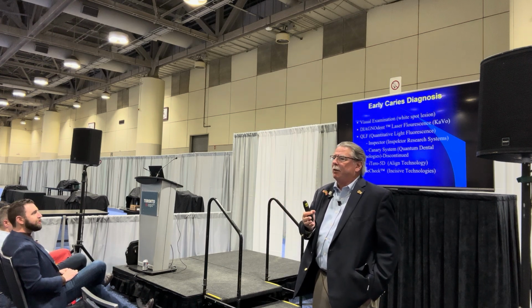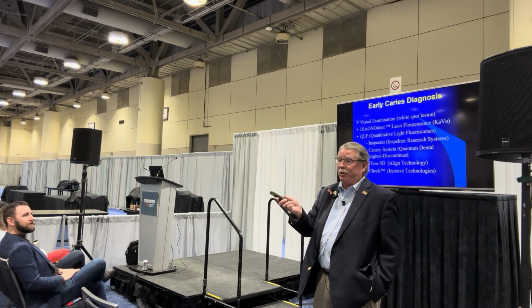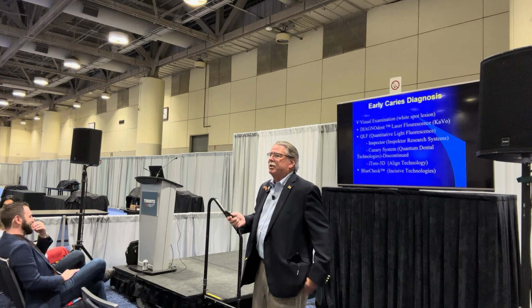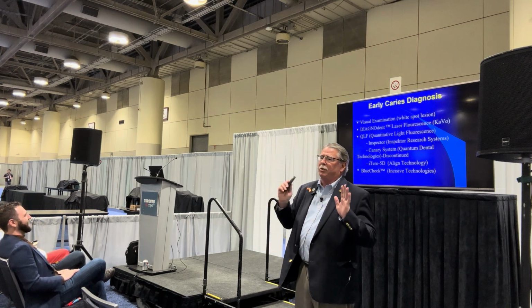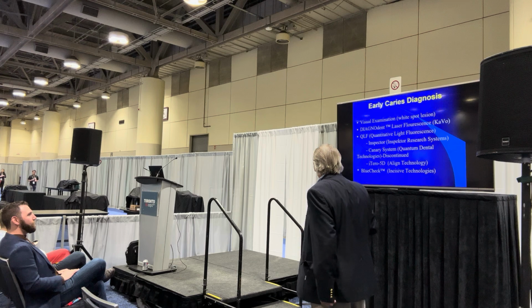So anyway, we did all these examinations to try to validate the different systems, and then we came back after that. We got the kids to give us their teeth back and paid them a fortune, and let me tell you, you get more teeth than ever was entered. They give you every tooth in their mouth. And so we got them back and we sectioned them and started looking at them with all these techniques. And we wanted to see if what we saw clinically, we also saw with microradiography and other microscopic methods.